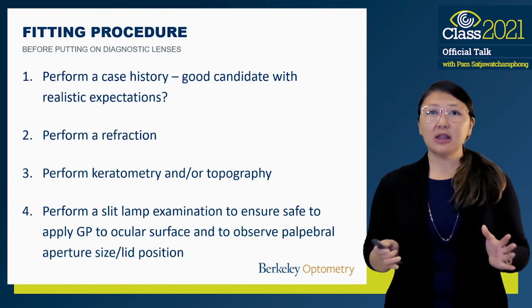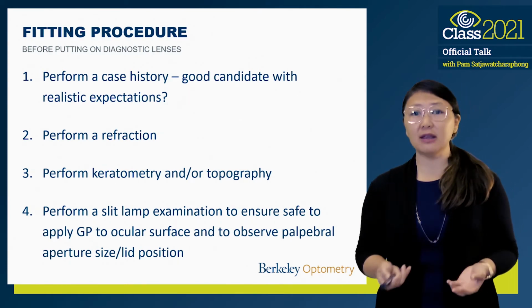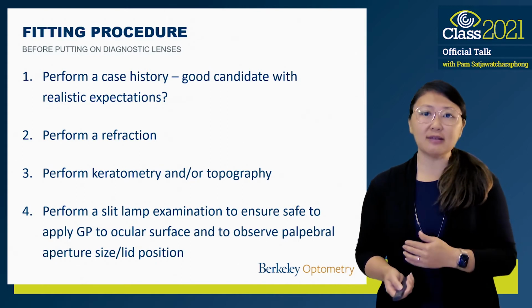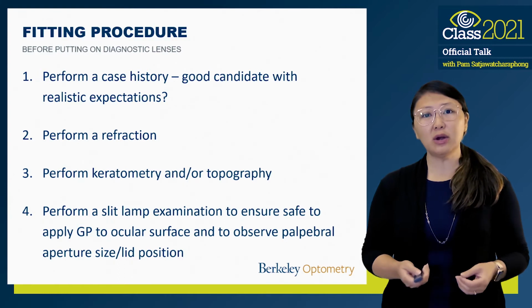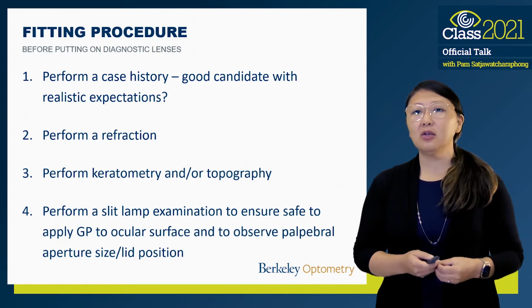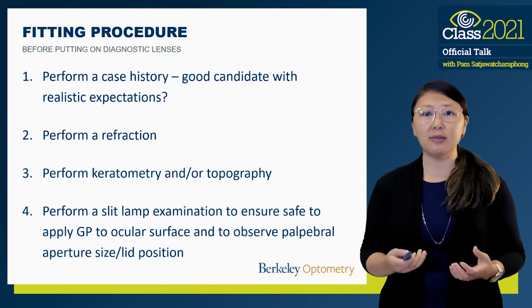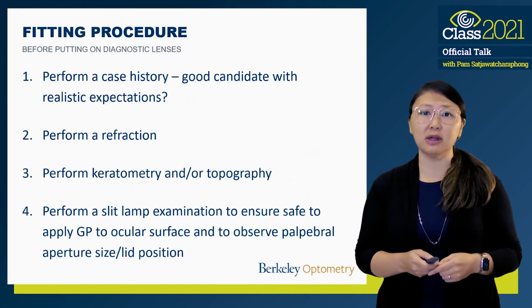So before putting diagnostic lenses on, what is the fitting procedure? Perform a good case history. Make sure that your patient is a good candidate and has realistic expectations about the adaptation process for GPs. Then you want to perform a good refraction. You need some sort of keratometry value, so whether that is manual or automated keratometry, or if you have a topographer available, that can also be utilized.